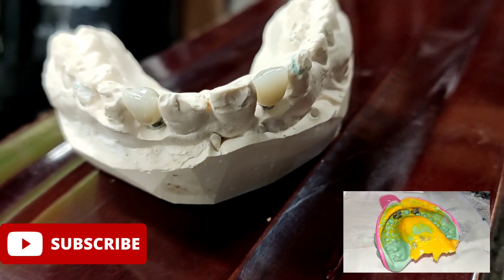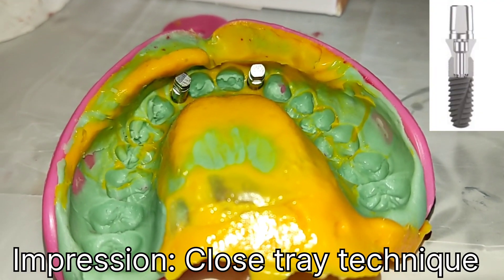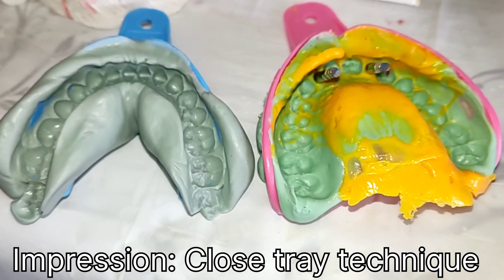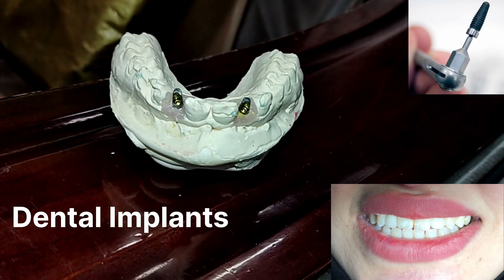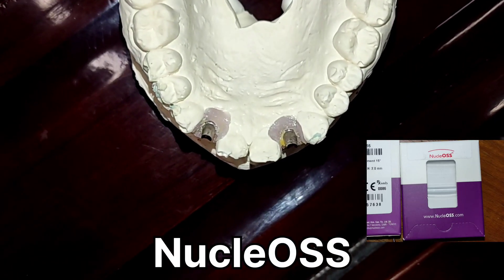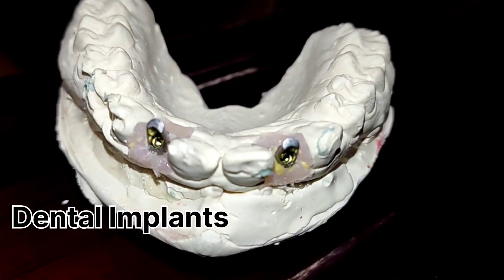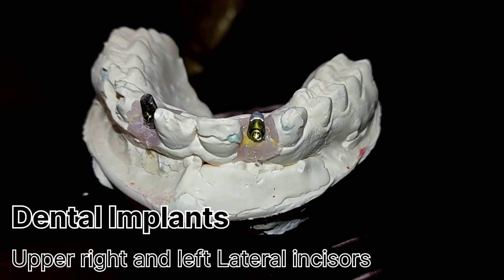Good day everyone. New video about dental implants — a clinical case at Dental Clinic, Dental Implant Prosthodontics. Close tray impression prosthetic part of dental implant after surgical insertion of fixture of upper left and right lateral incisors. Dental implant screw stability was tested, and this video covers the second step of dental implants. Brand used: Nucle OSS. Nucle OSS abutments shown on the master cast using the close tray impression technique done by a specialist prosthodontist, with silicone heavy body and light body consistency, plastic disposable trays, analog and post after removing healing abutments. Then insertion and cementation of zirconia crowns on dental implant abutments.